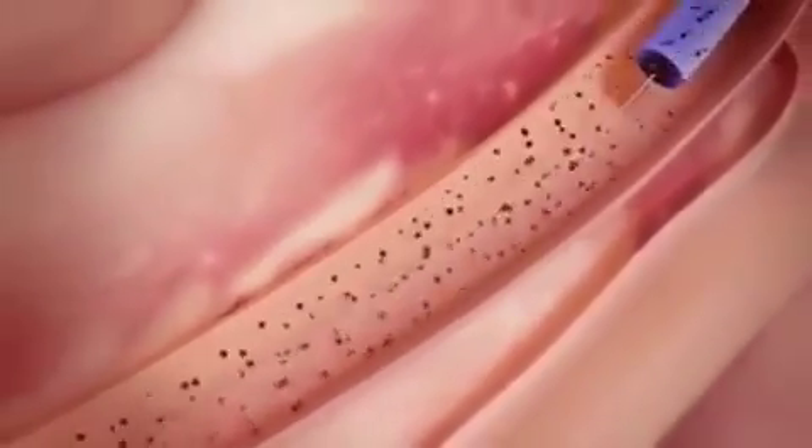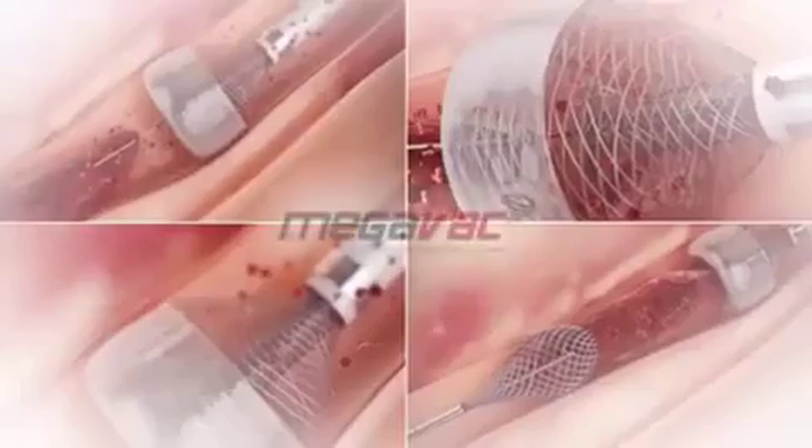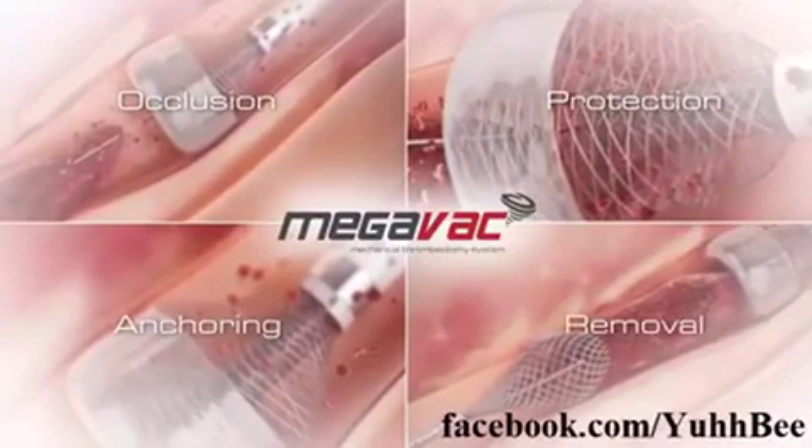Rapid removal of occlusive thrombus with vacuum extraction can accelerate door-to-balloon time and improve outcomes. Four features in one device: occlusion, protection, anchoring, and removal.